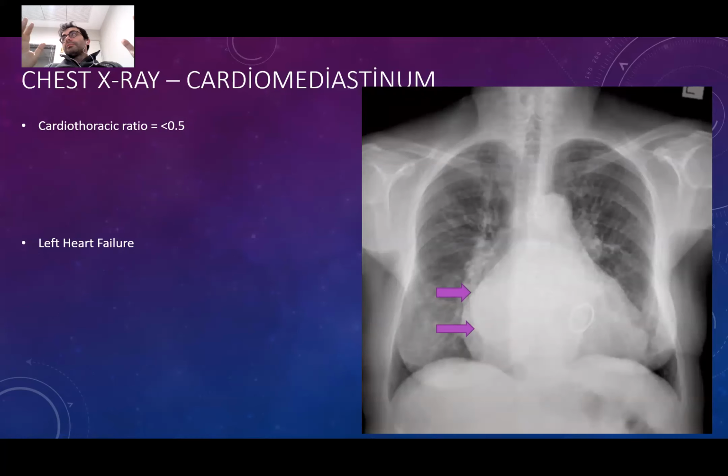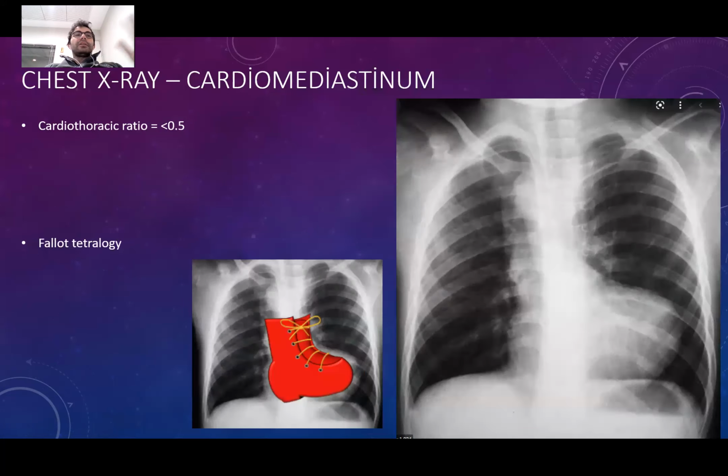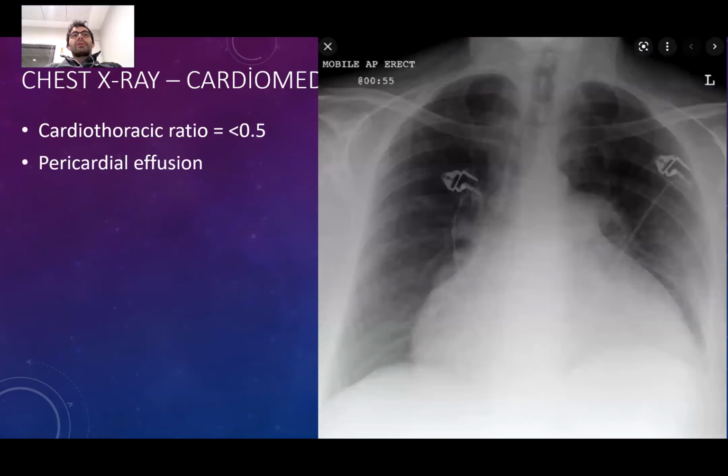These are technologies of the 70s. This was before we had CT scans with us. So the heart is either big or small. There are things like diagnosing tetralogy of Fallot with the chest X-ray, this or that, but these are obsolete now. These are very historical knowledge. You can forget about it.